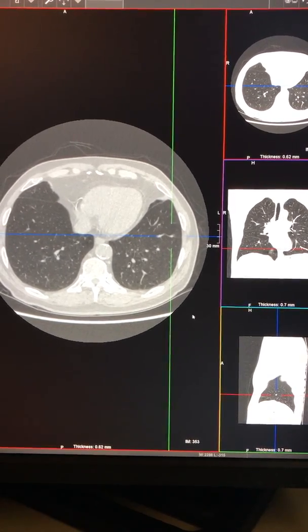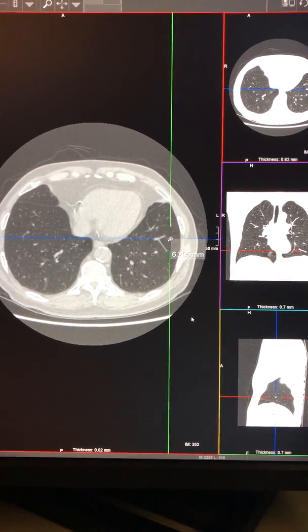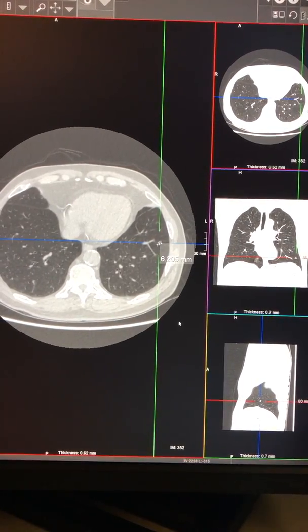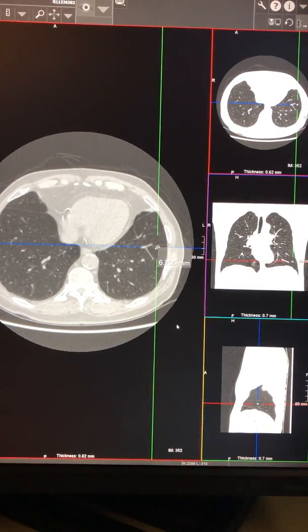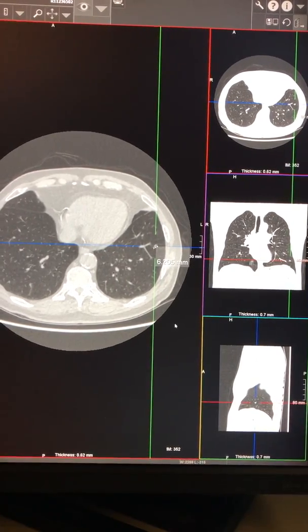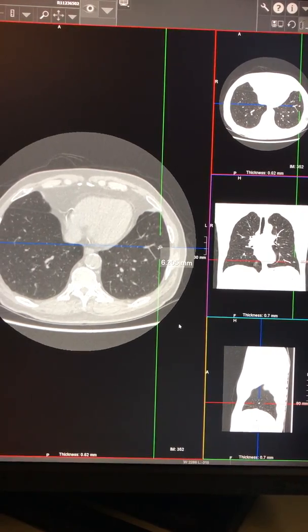A useful crude cutoff for follow-up guidelines on lung nodules is the actual longest axis dimension, and according to the Fleischner Society, the numbers to remember are 6 millimeters and 8 millimeters. If under 6 millimeters, usually follow-up in high-risk patients is optional and no follow-up is required under current guidelines.